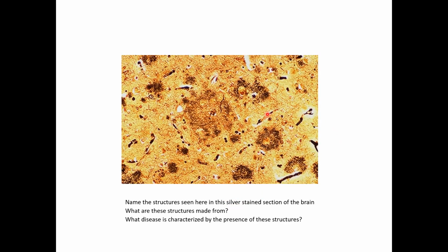One of the things that silver stain is used for is these plaques. دول البلاكس اللي سميناهم الأميلويد plaques عبارة عن center or core of abnormal amyloid deposition surrounded by هدول الفبريلز اللي حواليها are dystrophic neurites. عبارة عن neurites ميتة. Dystrophic neurites حوالين الأميلويد, the whole structure is an amyloid plaque. Disease that is characterized by the presence of these structures هو Alzheimer's disease.